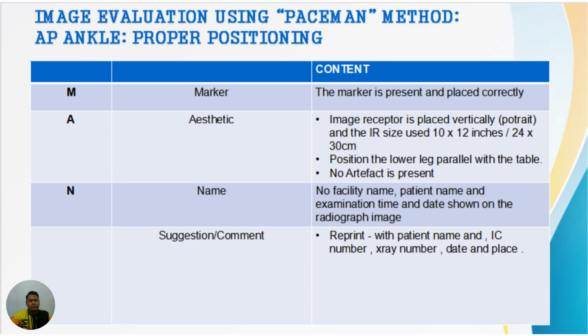N is for name. No facility name, patient name, and examination time and date are shown on this radiographic image in our study. Last but not least, suggestion or comment. Reprint with patient name and IC number, X-ray number, date, and place.